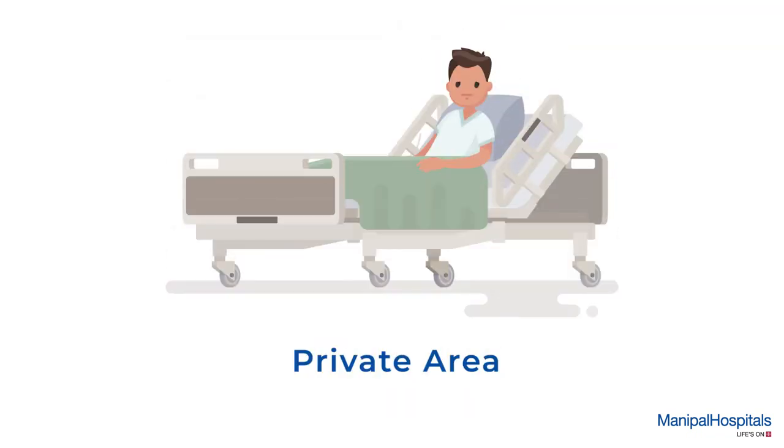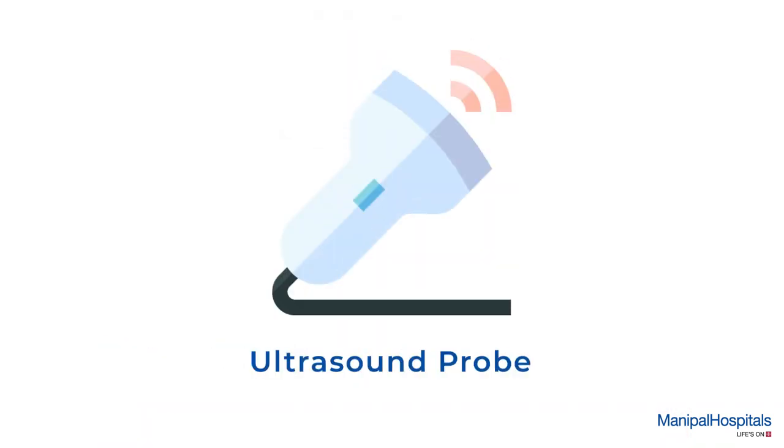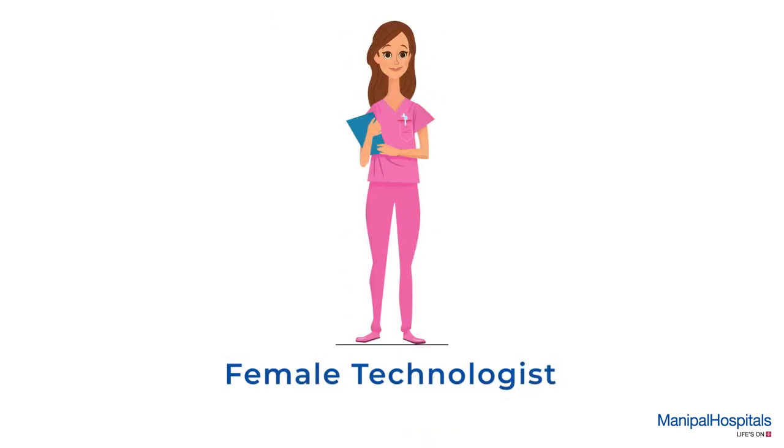During the procedure, you are given a hospital gown to change into and settled comfortably in a private area throughout. The technologist applies conducting gel on your chest, stomach and neck and uses an ultrasound probe to get different views of the heart. In case of female patients, the procedure is always performed by a female technologist.